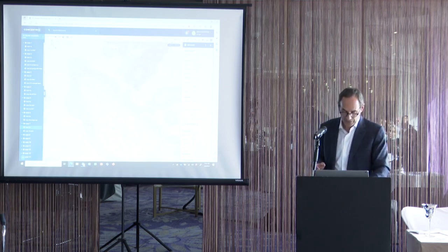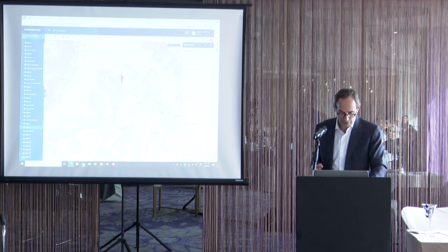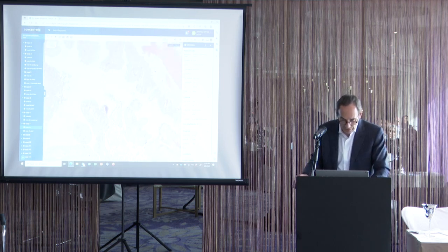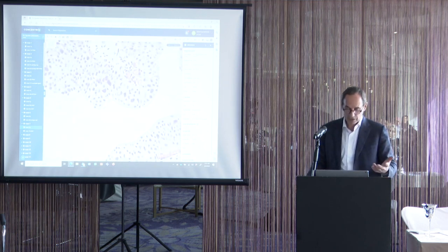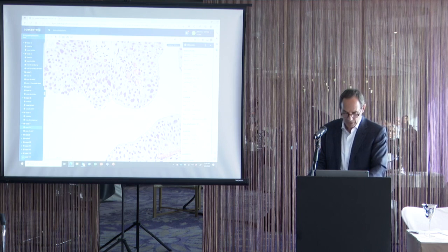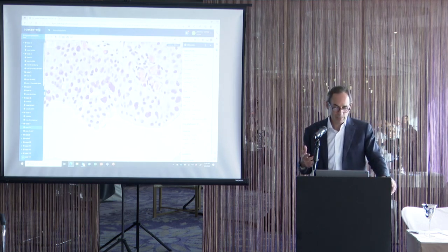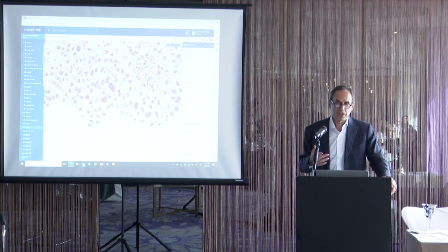And then the final thing you look for is cytology. Are these all pretty bland nuclei, or do we start seeing some larger atypical nuclei? When you go into this case, you say, this must be high grade because I see some of these big atypical nuclei. But when you look at these nuclei, that's not typical of a high-grade papillary urothelial cancer. Very smudgy, degenerative chromatin.